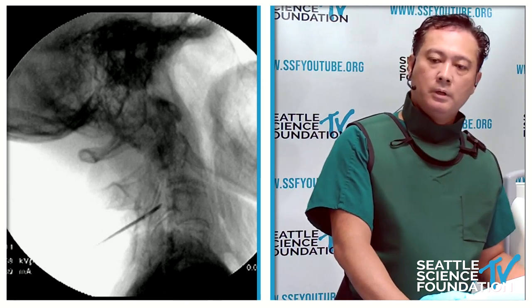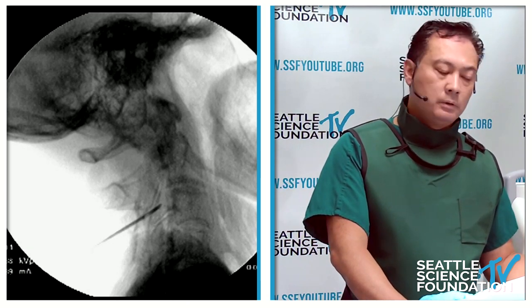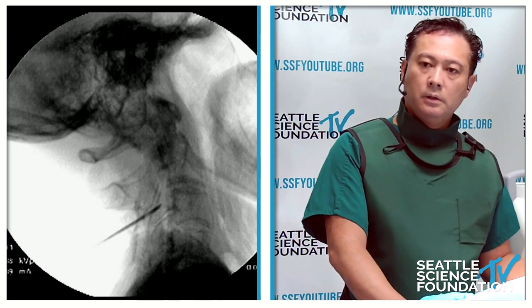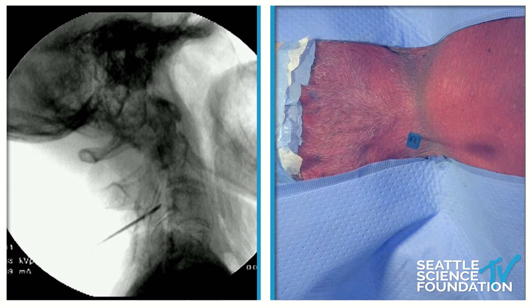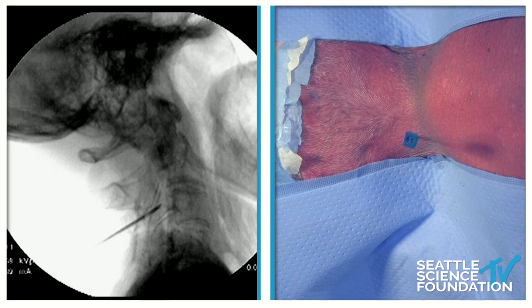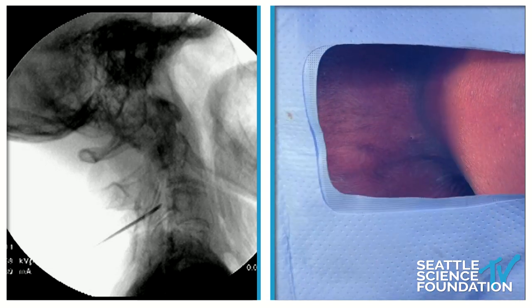Unfortunately with this cadaver, the shoulders are inhibiting visualization of C7 — visualization is virtually impossible due to the shoulders being in the way. In a live patient, if you've got to do C7 and the shoulders are in the way, you can tie a sheet to the foot of the bed and have the patient hold onto it, then cinch up the tension to pull the shoulders down. Some people tape the shoulders down. These are real-world issues. On cervical imaging, line up the C1 arch to know your wigwag, and oblique to make sure all the articular pillars line up.